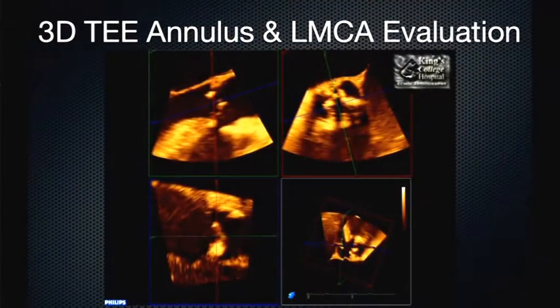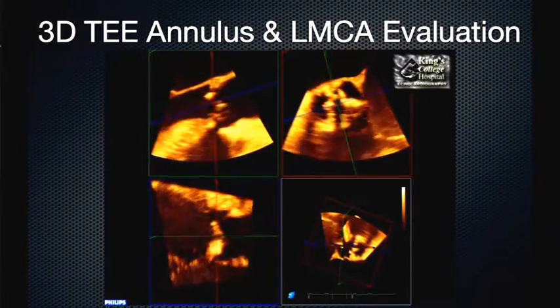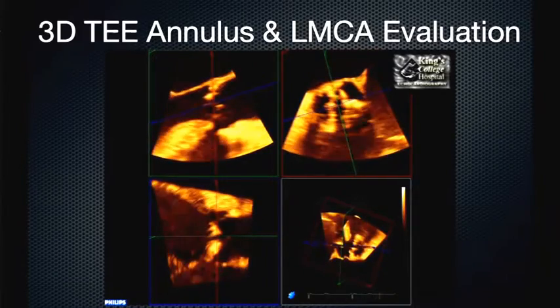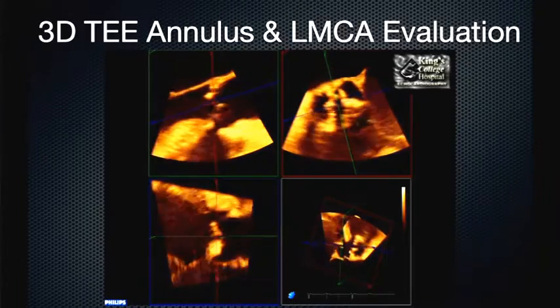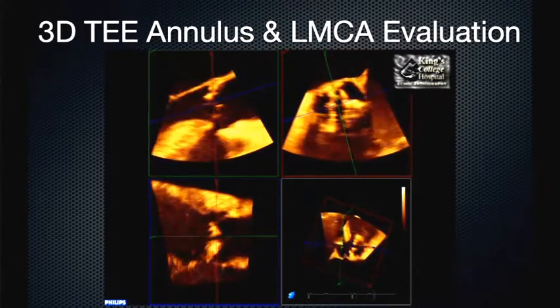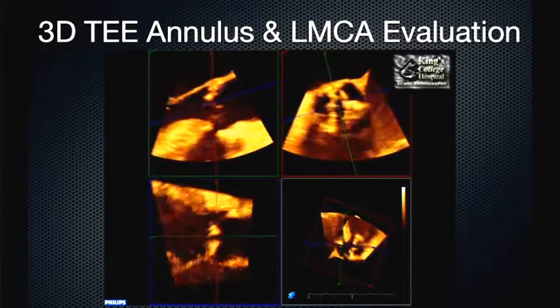And that can make it a little bit more challenging in terms of assessing it from either technique. Now, I'm going to focus on this part of the presentation on the use of 3D TE. And as I've mentioned elsewhere in this DVD, the technique I like to use is to acquire a 3D zoom data set incorporating the LV outflow tract, the aortic valve and the aortic root, all of which are key components in the assessment of patients for TAVI.